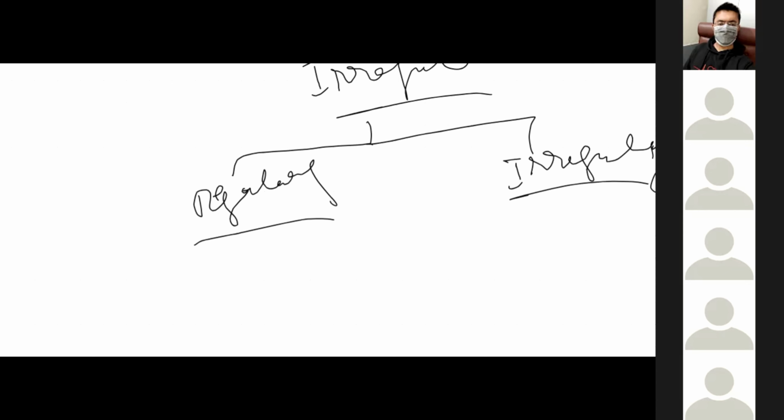You just pick up a card or a plain paper and mark two consecutive R waves on that paper, and then you run that specific part along the entire lead 2 of your ECG. This will give you a rough idea whether the rhythm is regularly irregular or irregularly irregular.